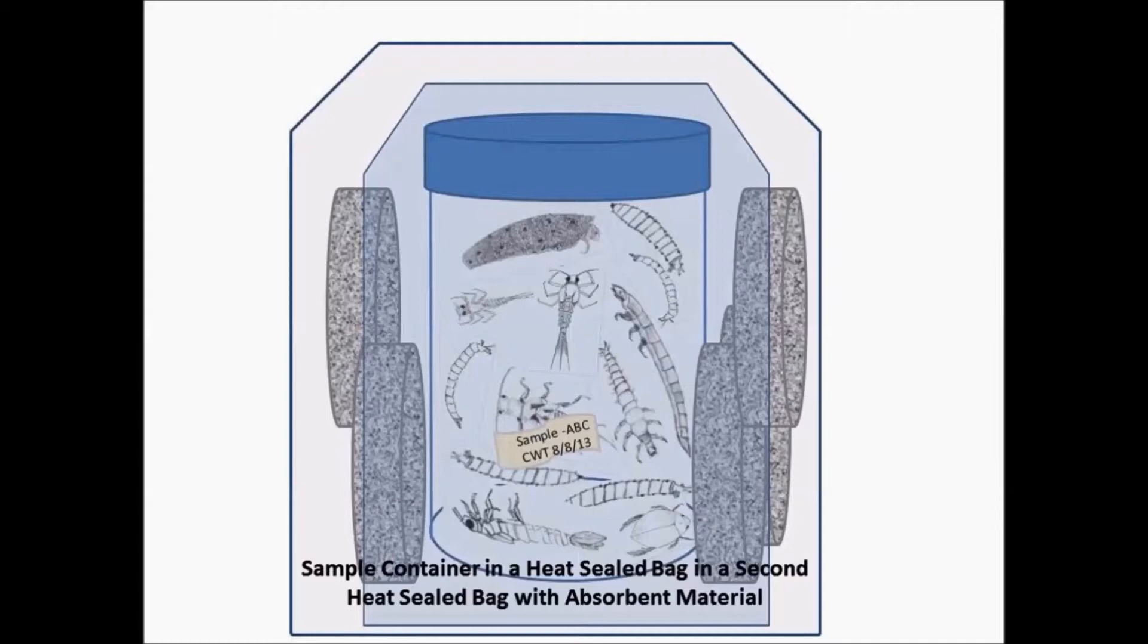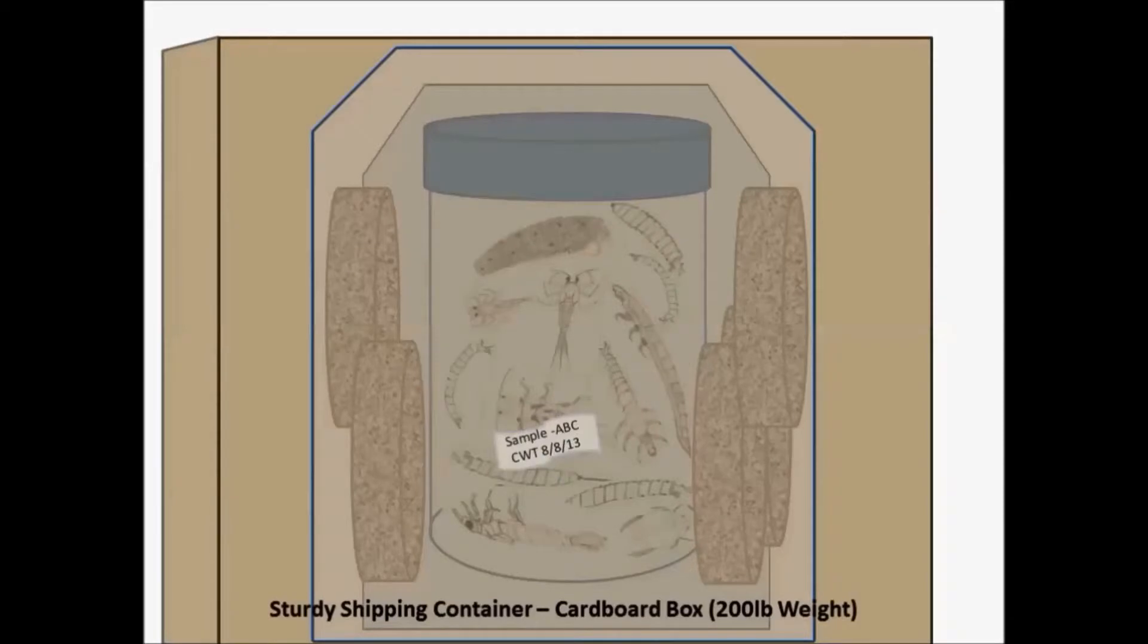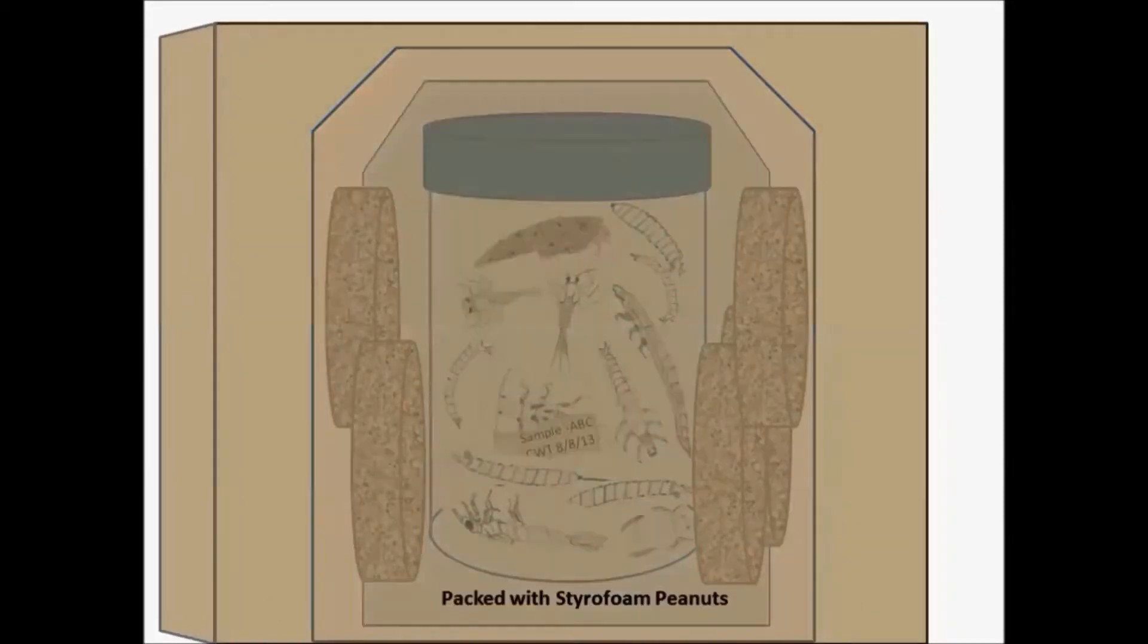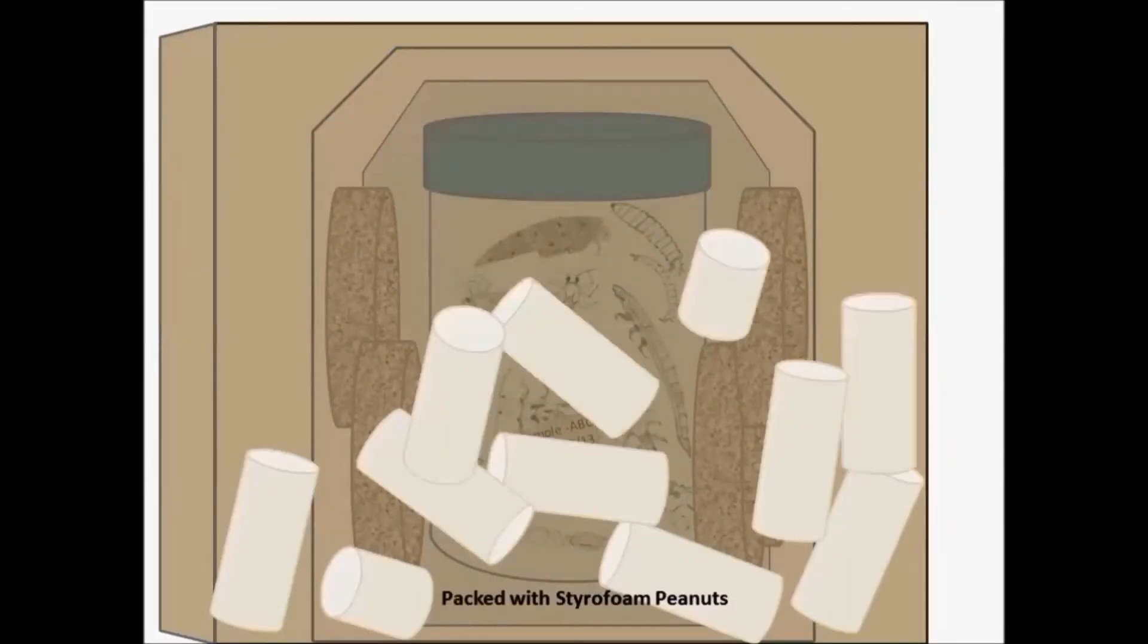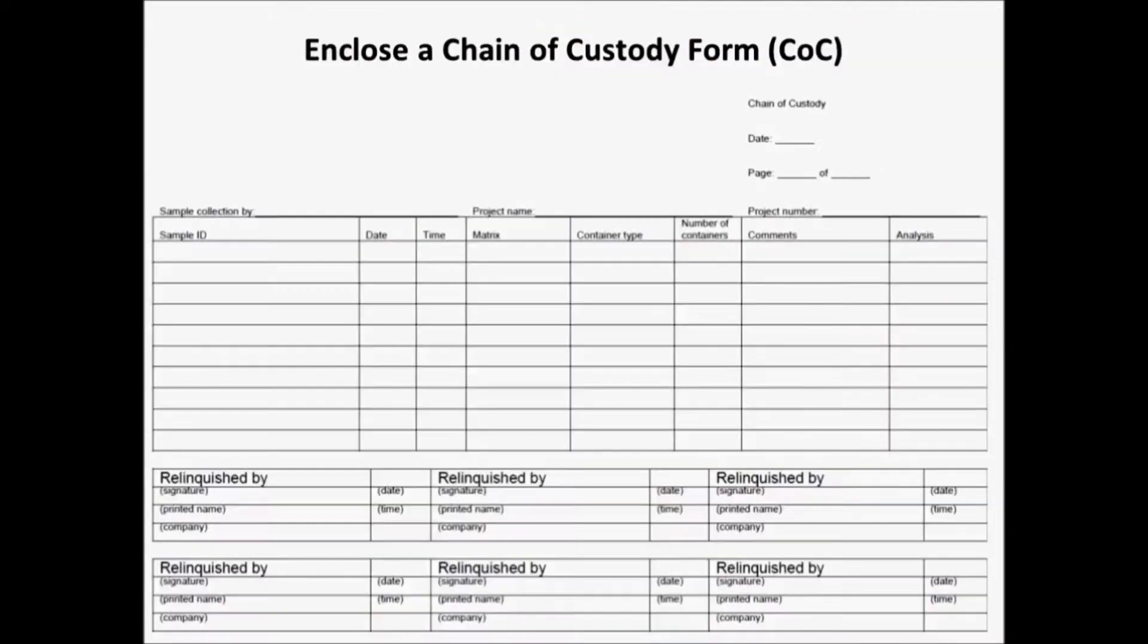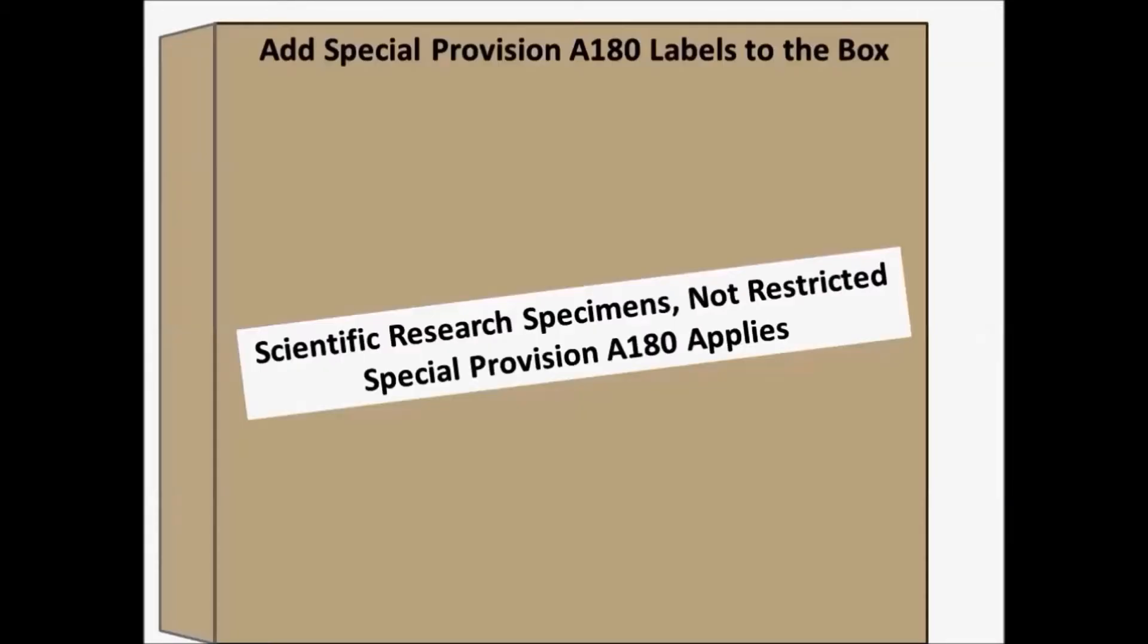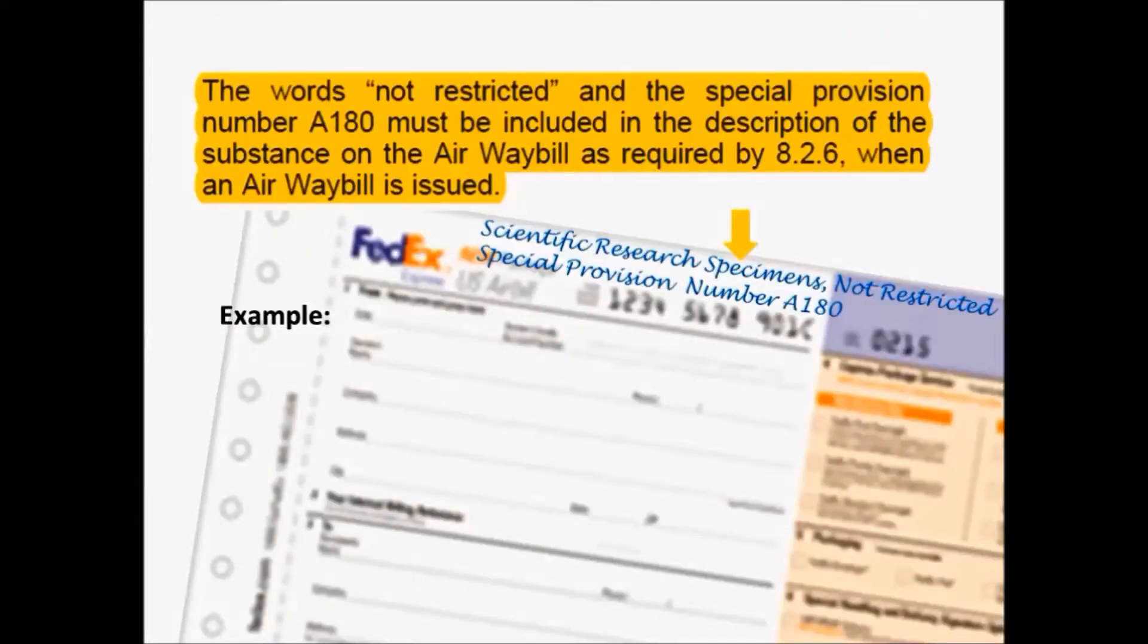You then take your sample and place it within a sturdy shipping container and fill it with styrofoam peanuts. On the outside of the box, add special provision A180 labels. And to your waybill, add the words NOT RESTRICTED and the special provision number A180.